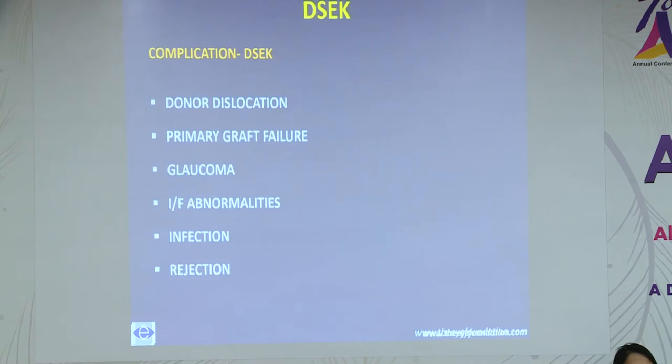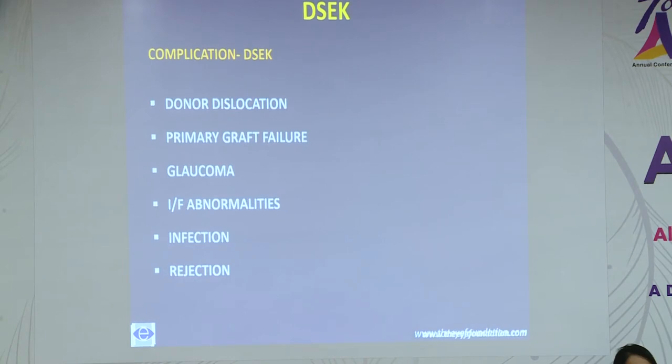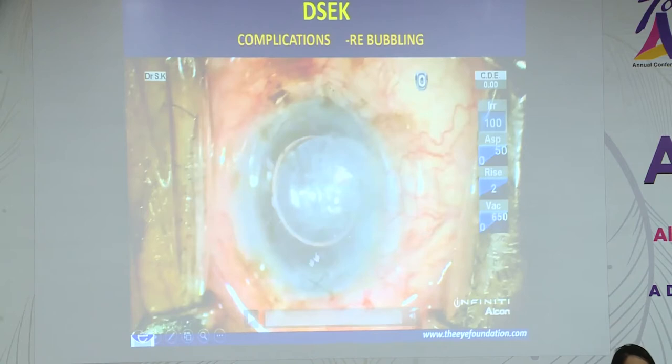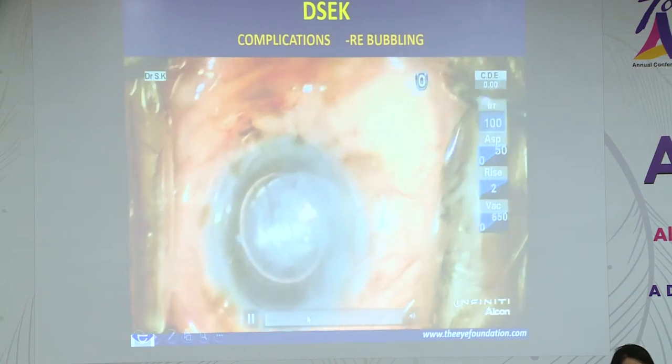So the complications associated with DSEK, in brief, are donor dislocation, primary graft failure due to traumatic insertion of the lenticule, glaucoma, interface abnormalities, interface infection or infection of the graft, and rejection of the graft. Of course, rejection of the graft is much less compared to penetrating keratoplasty. This is a case of lenticule separation and dislocation, and of course, it needs to be repositioned. This particular patient is taken up for surgery.